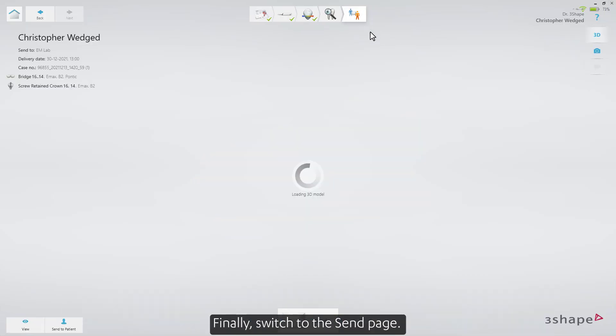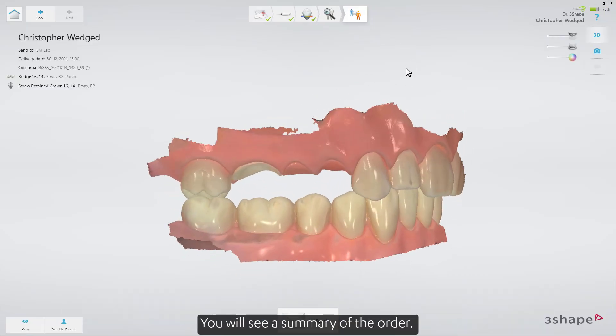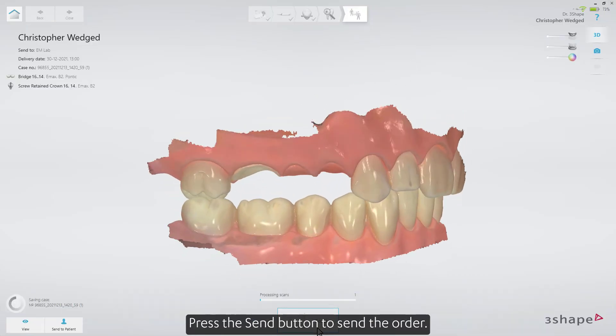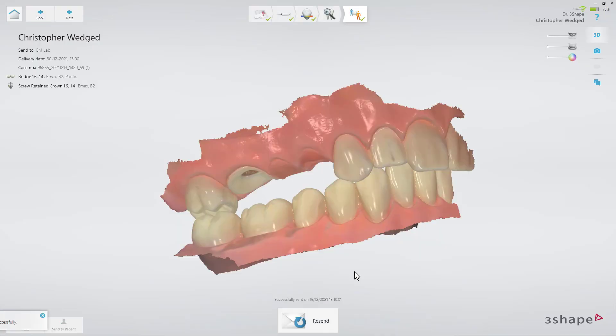Finally, switch to the Send page. You'll see a summary of the order. Press the Send button to send the order.